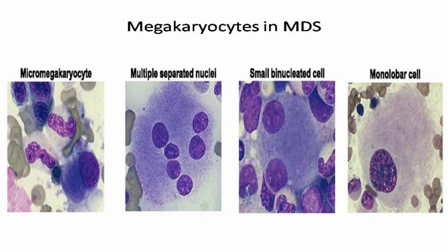These are the different abnormalities, and you see this middle one. It is very difficult to differentiate from any giant cell, an inflammatory giant cell. Even multinucleated normoblasts look like that. I had shown you the photographs in the previous erythroid series. Sometimes these can be mistaken for macrophages in the bone marrow.